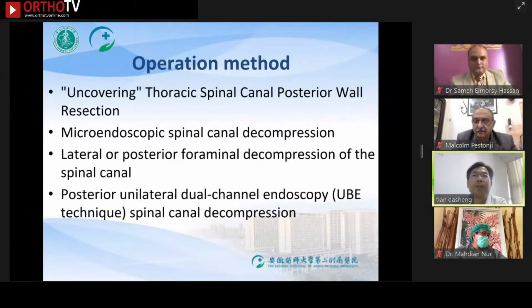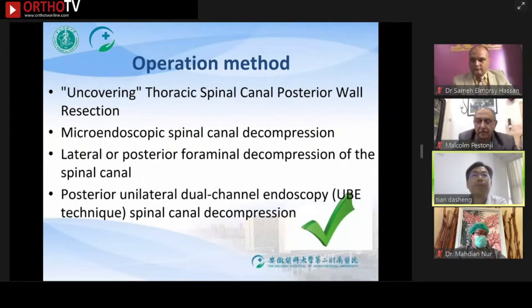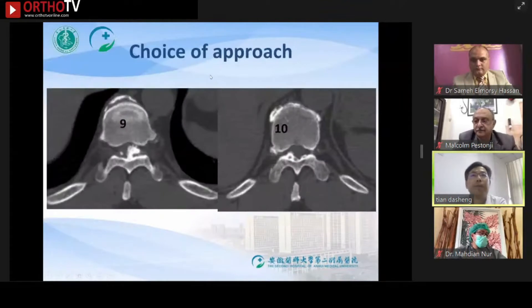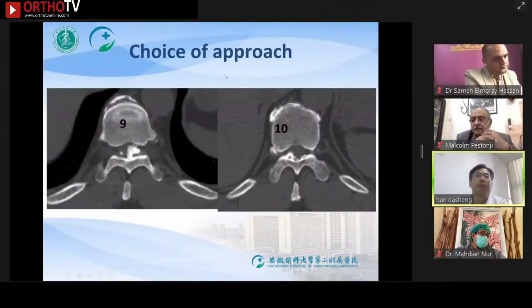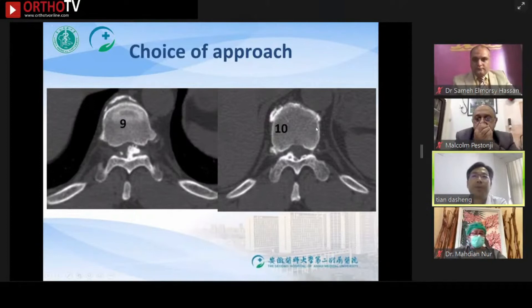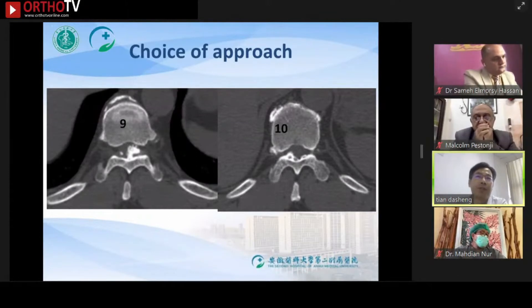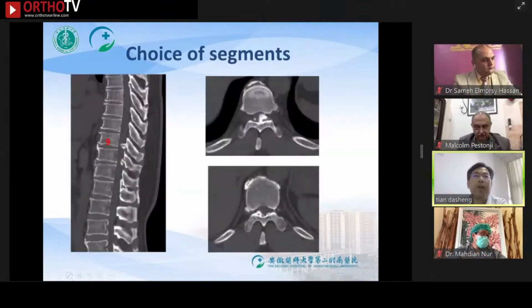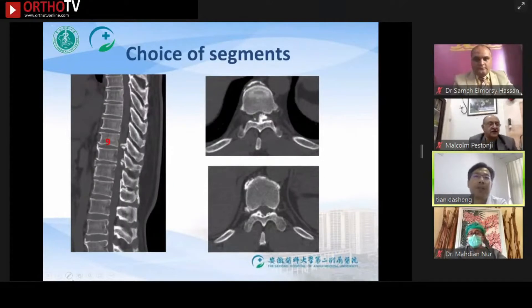For the choice of surgical method, we chose UBE — unilateral biportal endoscopy. One ossification is on the left side and the other is on the right side. How to choose the approach — left or right? Because it was the first case, we chose the more severely compressed side, that is the left side. There are two compressed segments, one with lighter compression and the other with heavier compression.